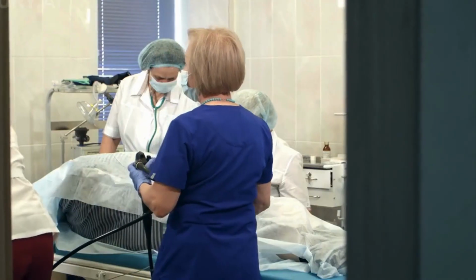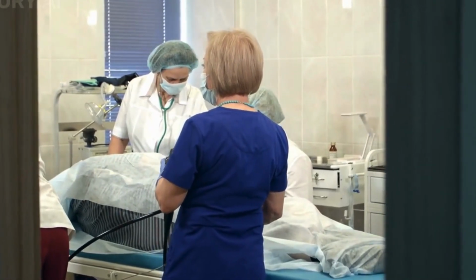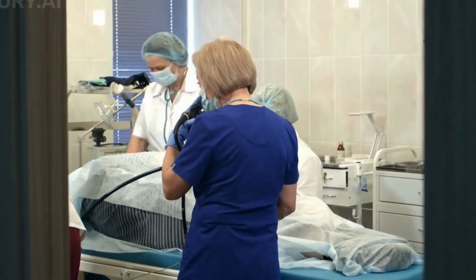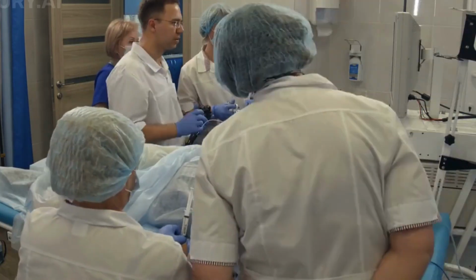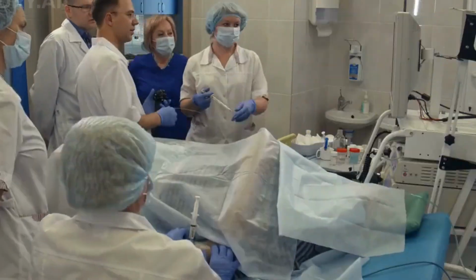Endoscopic procedures have revolutionized modern medicine by offering minimally invasive techniques to diagnose and treat various conditions. These procedures involve using an endoscope, a flexible tube with a camera and light attached, to visualize internal organs and tissues. Let's delve into the indications, types, process, risks, and potential complications associated with endoscopic procedures.